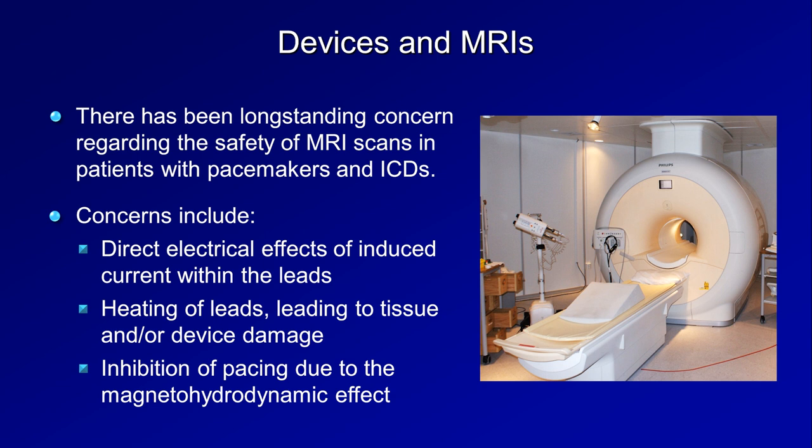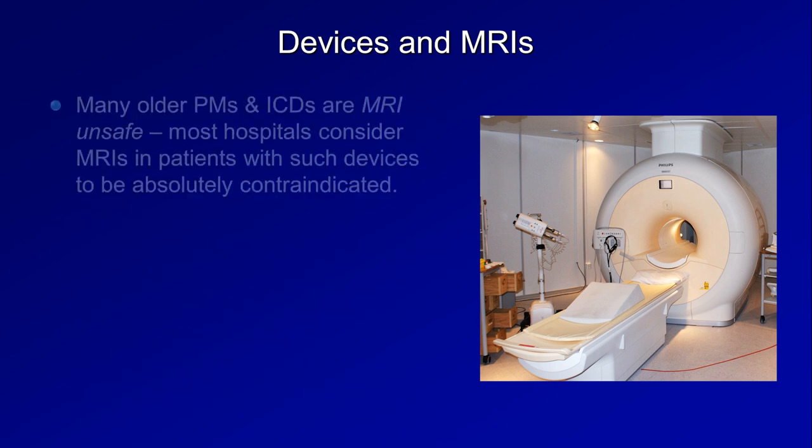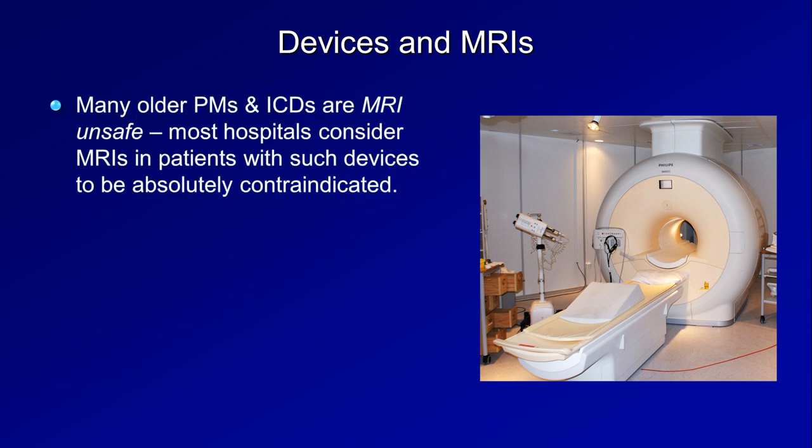This is only a risk in extremely powerful magnetic fields that are oriented in a specific direction. It will not happen with the kind of magnet a person could encounter in everyday life. The majority of older pacemakers and ICDs are MRI unsafe, meaning that most hospitals consider MRIs in patients with such devices to be absolutely contraindicated.